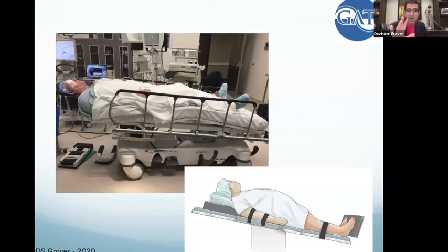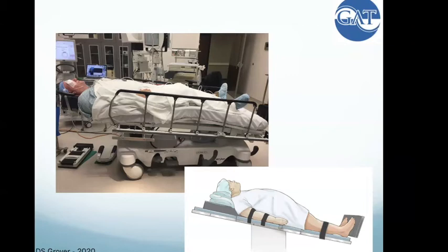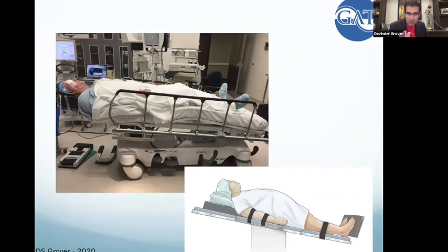So I think there are a lot of reasons to be safe and keep the patient like this during all surgeries. I do that with everything, with my phacos, trabs, tubes, everything. Also with phaco? Everything with phaco too, just like this, because you minimize episcleral venous pressure, and I think that minimizes your risk of a suprachoroidal hemorrhage on the table. So I think it keeps everything safer.